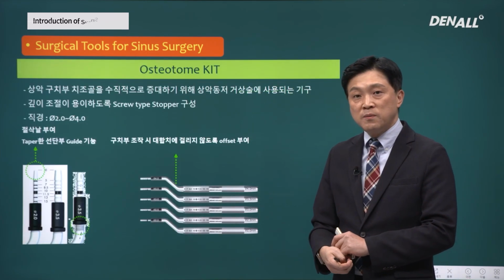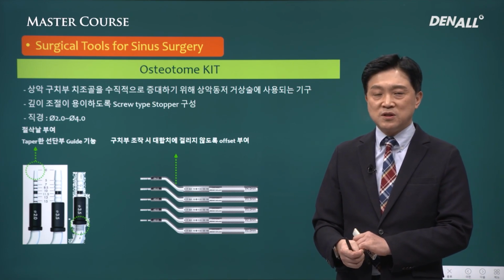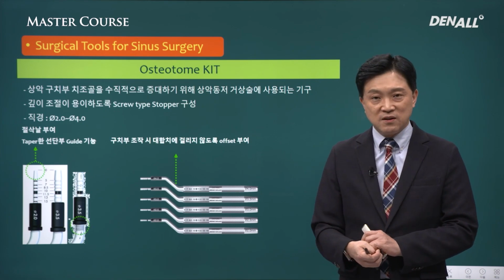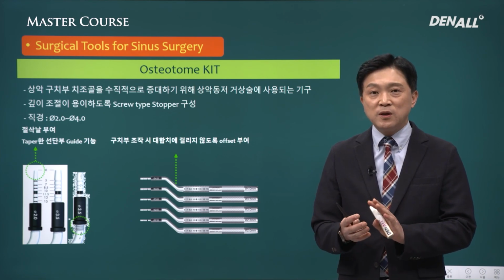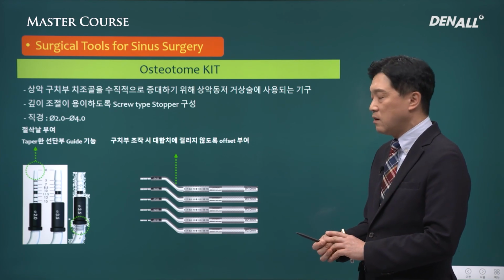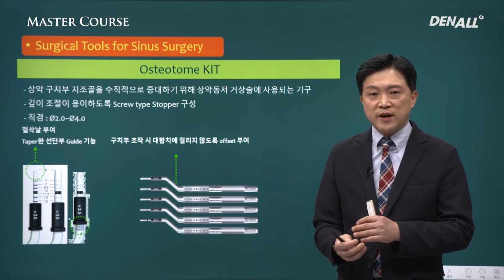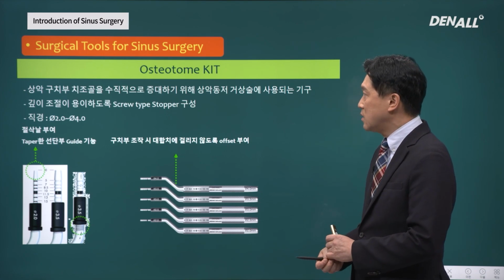Let me first explain about osteotome. Honestly speaking, we rarely use osteotome when doing crestal approach. However, you need to have it. If you do not have it in your store, then you will not be able to respond to situations where it's necessary. Personally, if you think you're going to do sinus surgery, then I think it's mandatory that you have it.